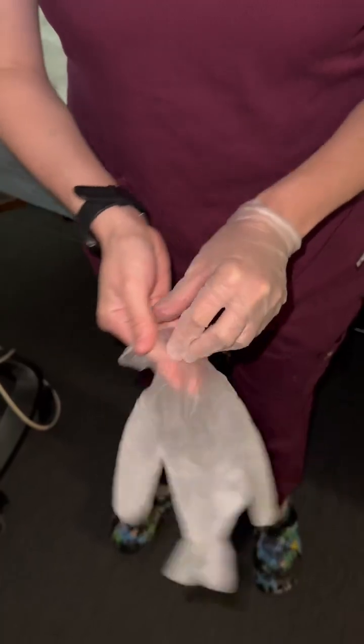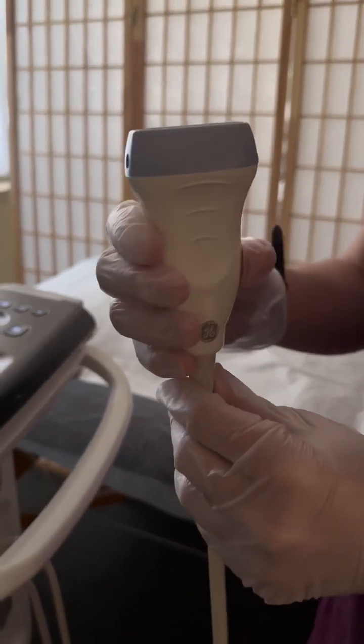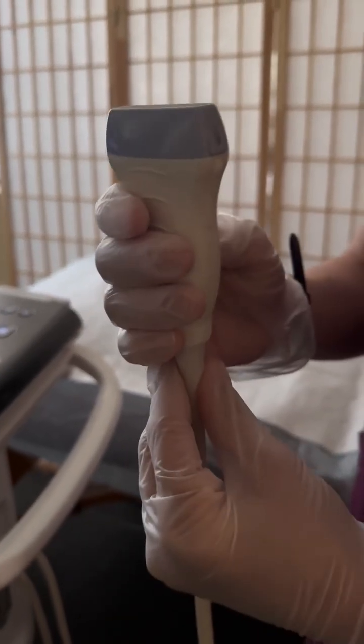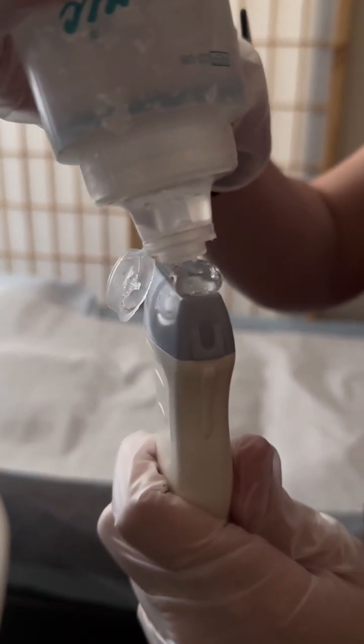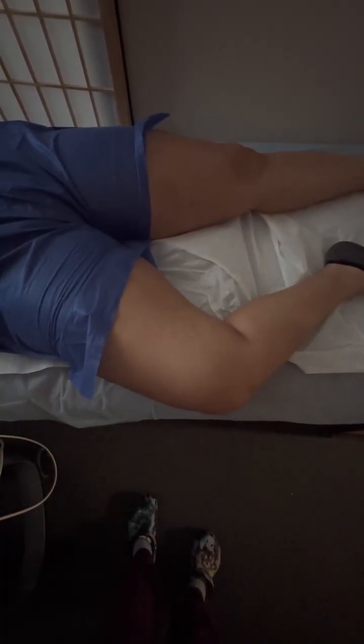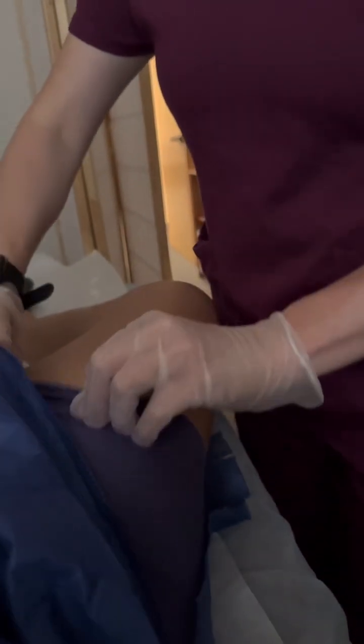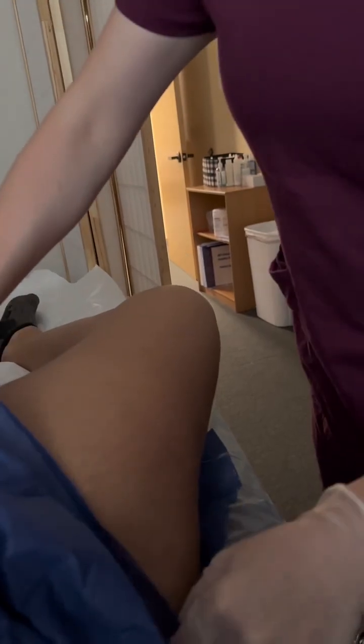First, I'm going to go ahead and put on some gloves before touching the patient or the equipment. For this protocol, we're going to use a linear probe, which is best used for vascular imaging. I'm then going to apply some gel onto the probe. The patient should be in supine position with the knee slightly flexed out. I'm then going to roll up the shorts because I will be scanning from the groin to the knee.